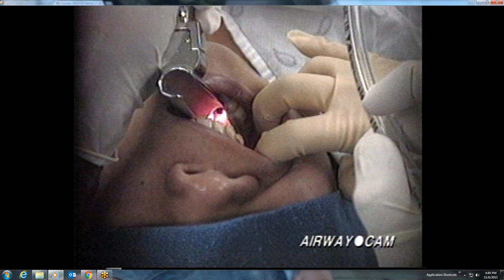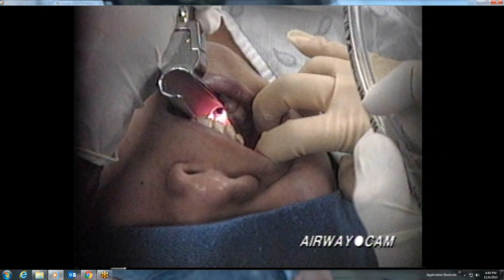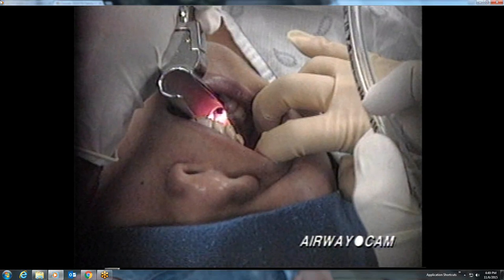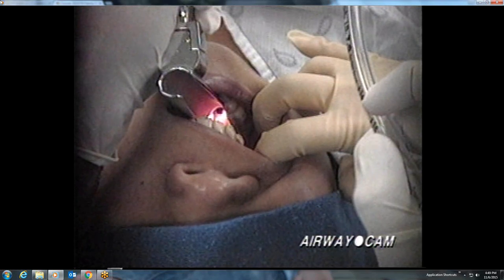The Miller blade has a much smaller flange. In an emergency situation, such as with massive tongue swelling, an endotracheal tube can be placed directly down the large barrel of the Wisconsin blade, although tube passage from the right side in order not to block the line of sight is recommended.